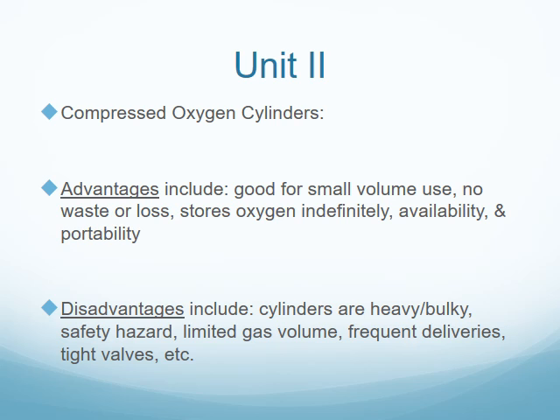So for advantages, one thing that is great is the fact it's good for small volume use, no waste, no loss, stores oxygen indefinitely. You don't have to worry about it leaking too much. And it's very available and it's portable. So like I said before, you can put it in a tank holder and take it with you without any trouble. It is kind of bulky if you have the big tank, but you can be pretty mobile.